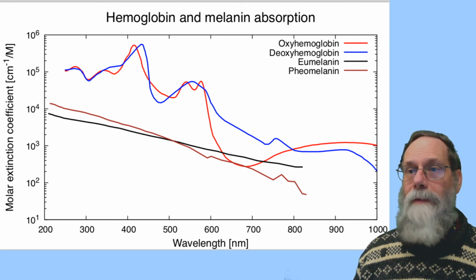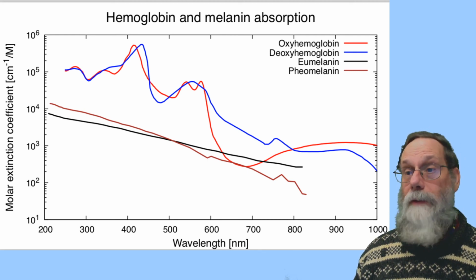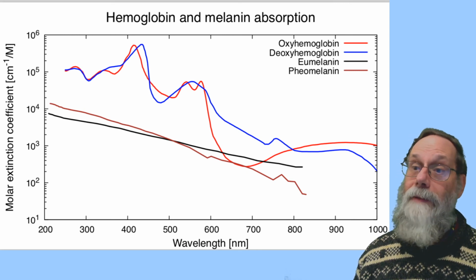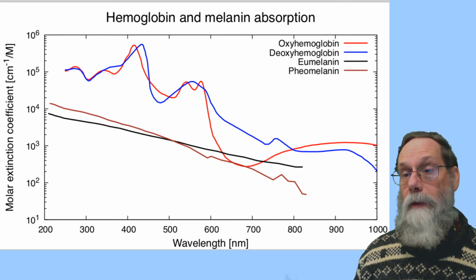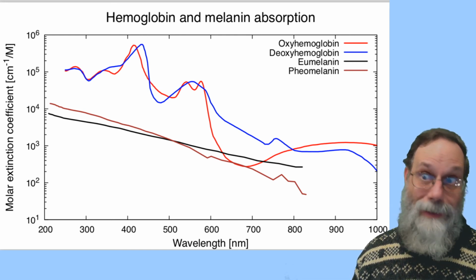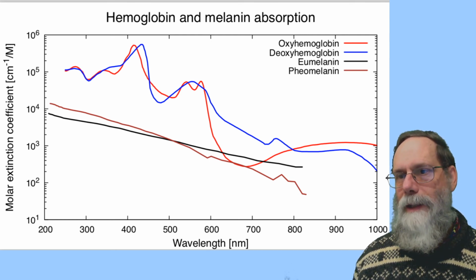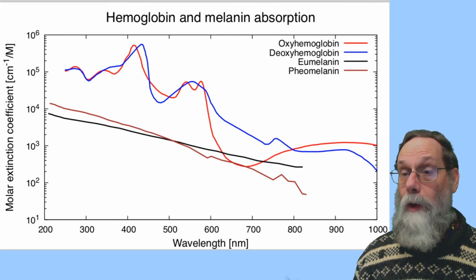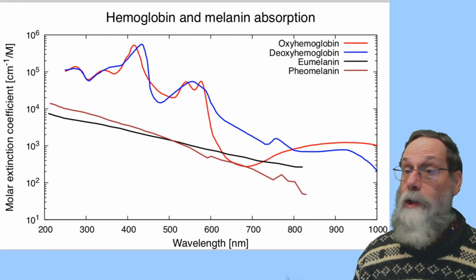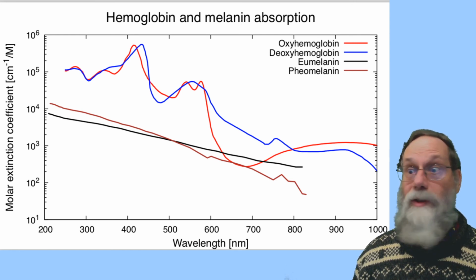And this was really bad PR for Apple. It was a really bad design. It's a result of having insufficient diversity on their engineering task force. They didn't even think to test on people with very dark skin. Once this problem came out, they of course went back and did the testing and I think upped the brightness of the LEDs so that it would work. But it was a very embarrassing sort of engineering mistake to make, and one that was so easily avoided too.